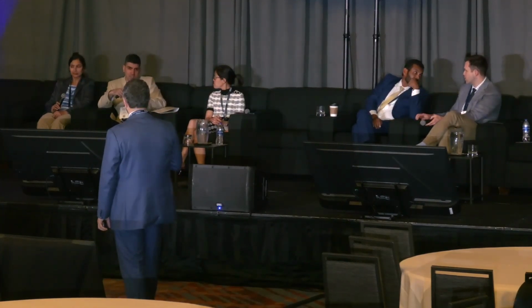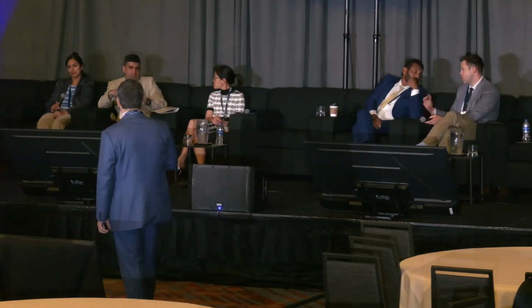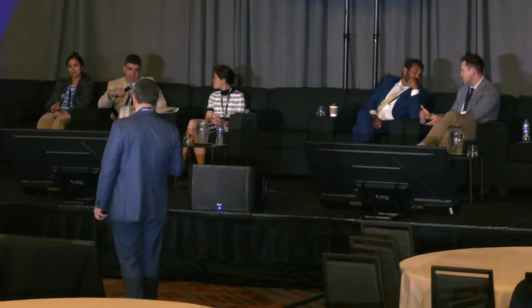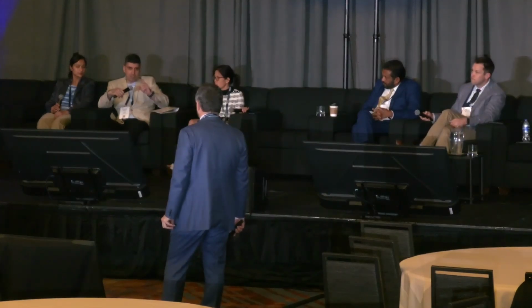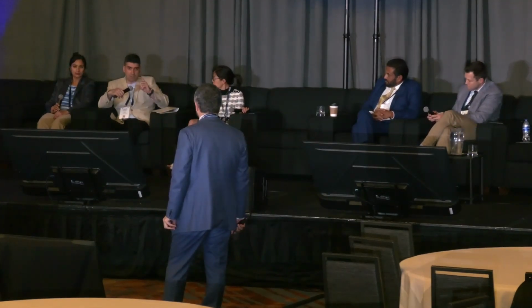I think the patient presentation should dictate what you do. In this case, she had very mild symptoms. At most, she's a stage 1 acute limb, if not even less. Then honestly, I would not balloon. She has good flow, she has no symptoms. I would do lysis, second day check. I would protect the profunda with a filter if there's still residual clot in the CFA. If there's no clot in the CFA and they want to fix the SFA, because we need to figure out the underlying issue, why she thrombosed, there's something wrong with that stent.